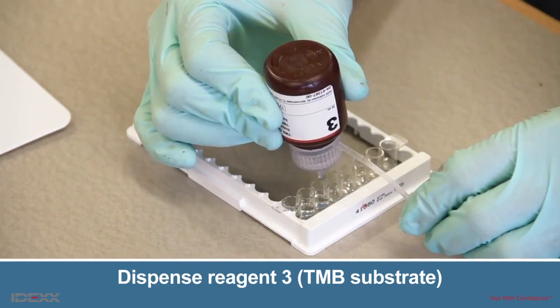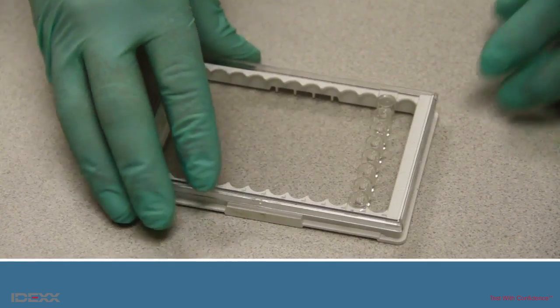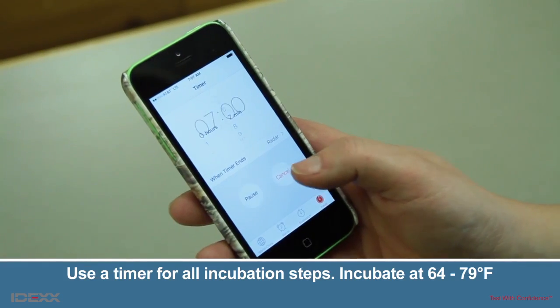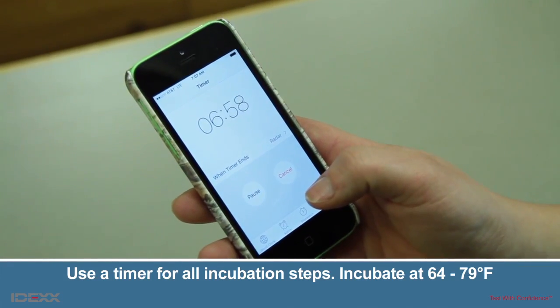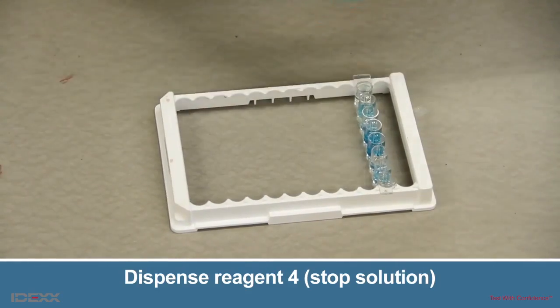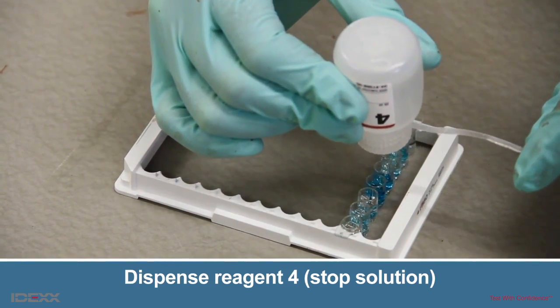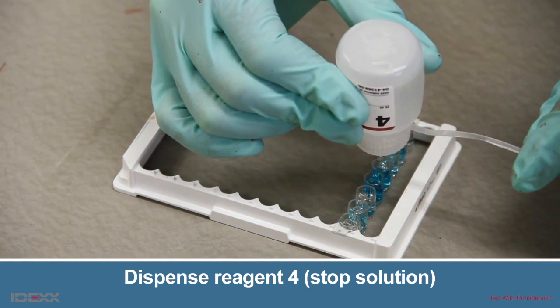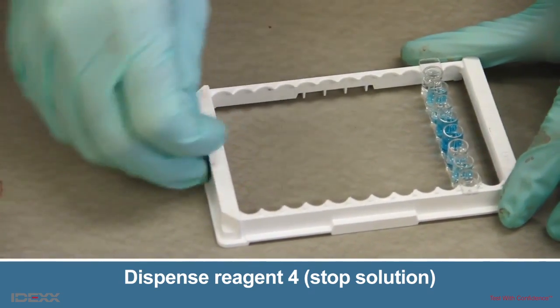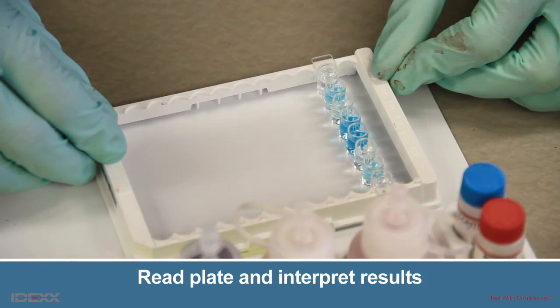Dispense three drops of Reagent 3 into each well. Cover the wells with the plate cover and gently tap the plate 10 times to mix. Start the timer and incubate the plate for seven minutes at 64 to 79 degrees Fahrenheit. After the seven minutes of incubation, do not wash the plate. Remove the cover and dispense three drops of Reagent 4 into each well, then gently tap the plate 10 times to mix. Place the plate on a white surface and take a visual reading.